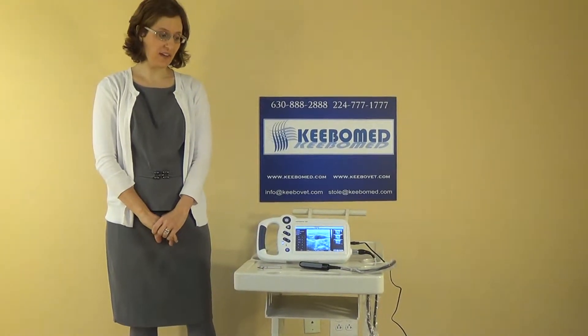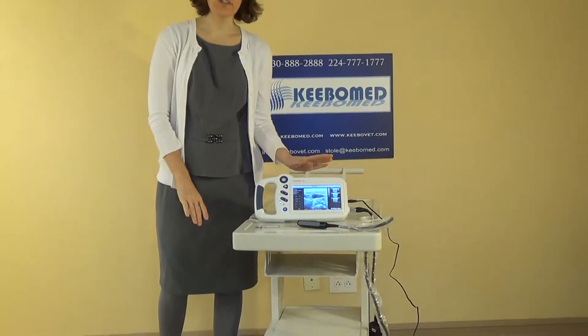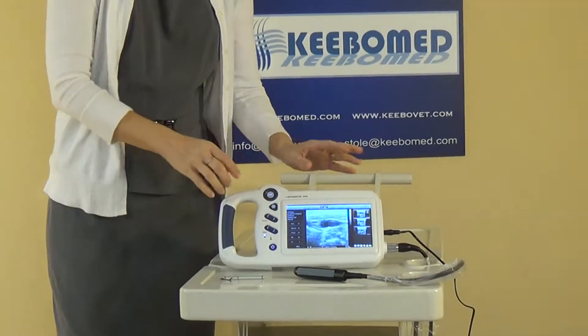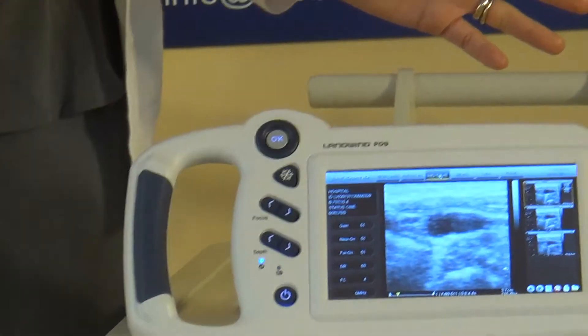The Lanwin Neocrystal P09 VET Palm Ultrasound is very convenient. What makes this special is that it's a touch screen, so you no longer have those confusing buttons that you have to push to do one feature. It's just a touch screen.